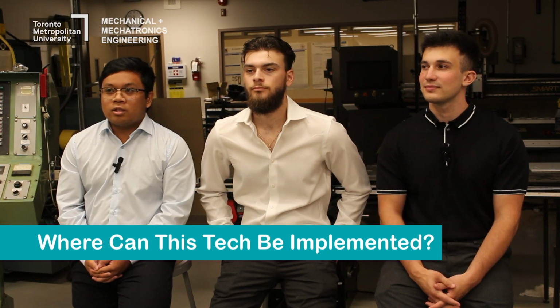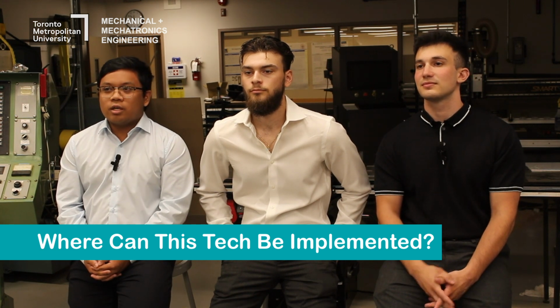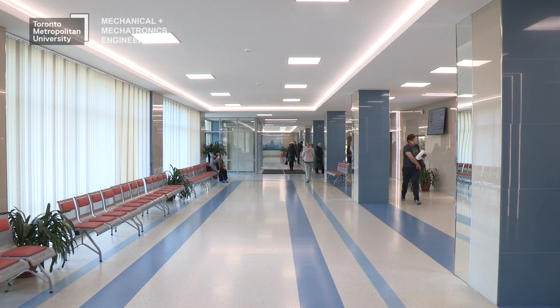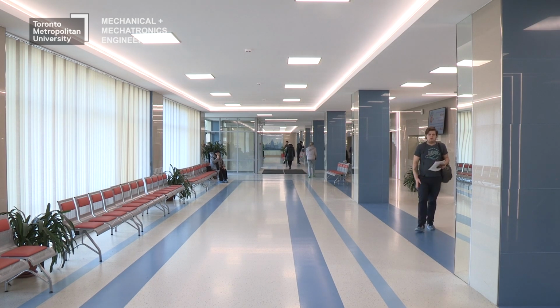Our capstone supervisor, Dr. Karush, is actually talking to some doctors at a hospital. One of the issues they found is that a lot of these rehabilitation devices that use haptic feedback are really expensive or not as accessible to people that need them. They're usually a lot larger in size and cost a lot, so the patient that needs this type of rehabilitation would have to go to the hospitals. We wanted to make a device that was significantly cheaper and that the patient would be able to bring home and use whenever they would like.